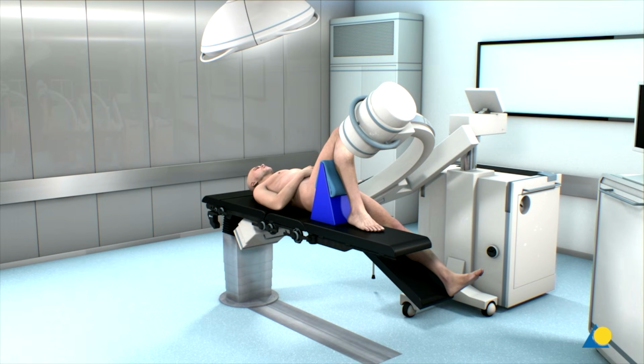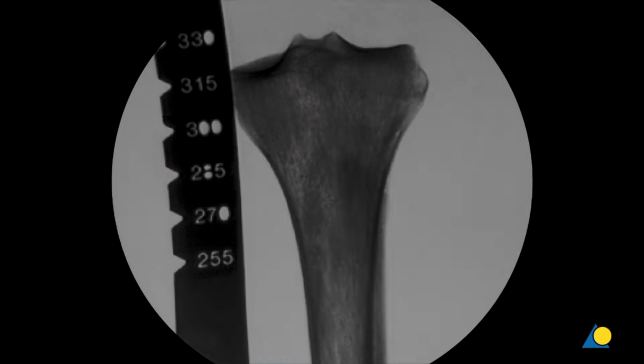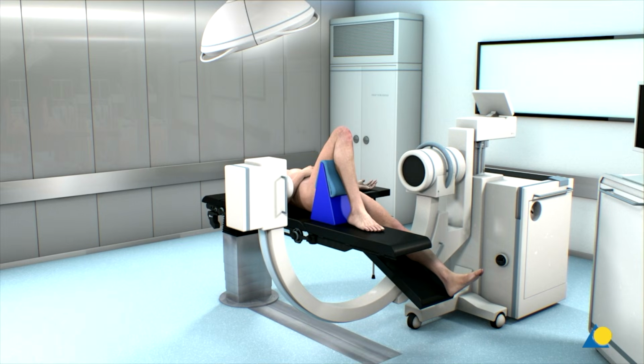The C-arm is repositioned to the proximal tibia, the distal end of the ruler is relocated to the skin mark, and an AP image is taken of the proximal tibia. The nail length is read directly from the ruler image, and the measurement at or just below the level of the anterior edge of the tibial plateau is used. The C-arm is then positioned for an AP or lateral view of the tibia at the level of the isthmus. The ruler is held over the tibia so that the diameter gauge is centered over the narrowest part of the medullary canal. The diameter measurement is read from the circular indicator that fills the canal.